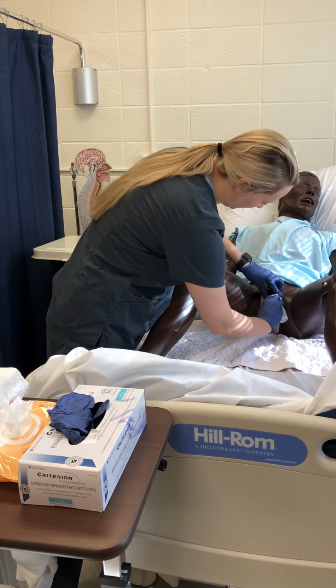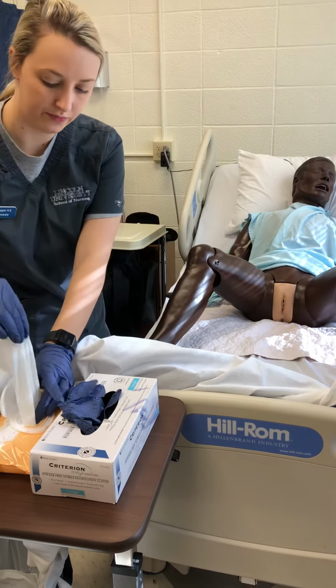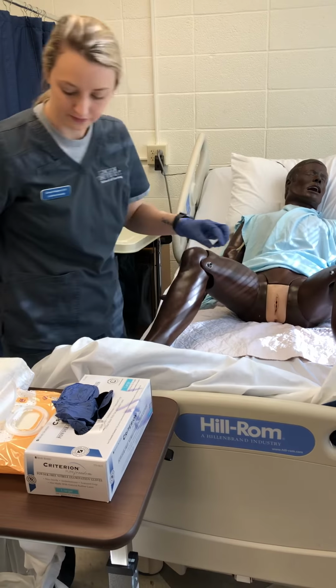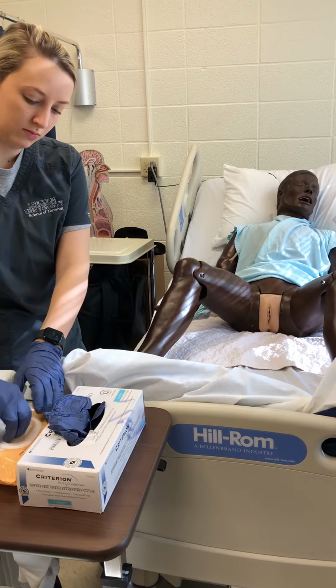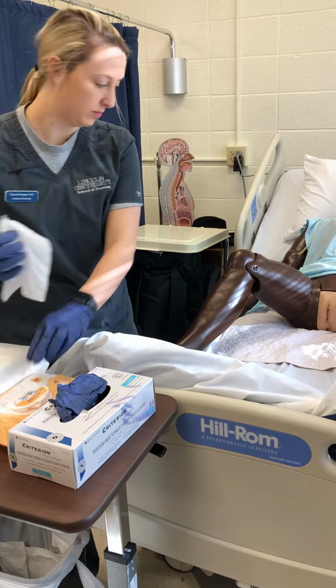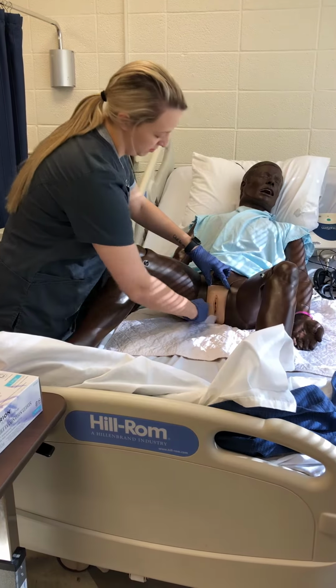I'm just going to wipe each side first. Cold wipe. And last one. Okay.